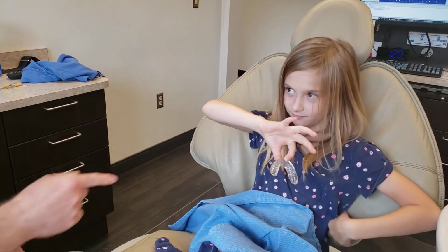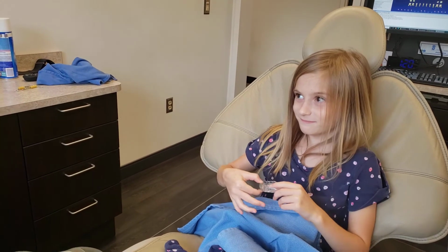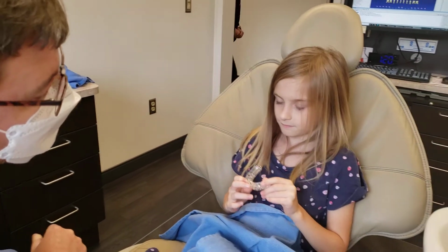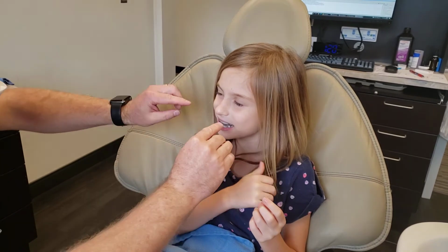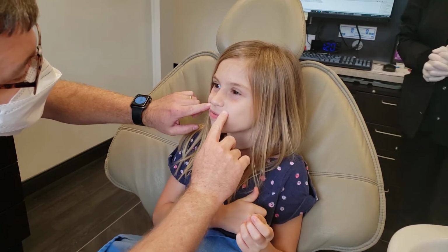All right. So can you tell what's the top and what's the bottom? This is the top. All right. So do you remember how I showed your brother how to put it in? All right. See if you can put it in like that. Perfect. Now smile real big. Let me lift your lip up a little bit higher. Now kind of squeeze your teeth together.